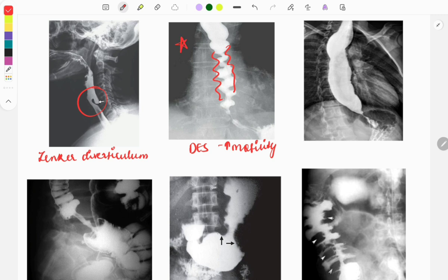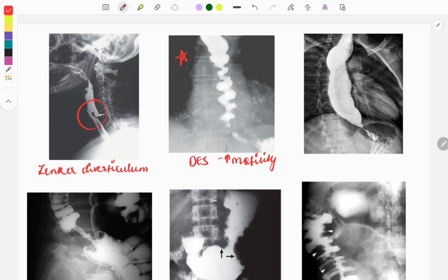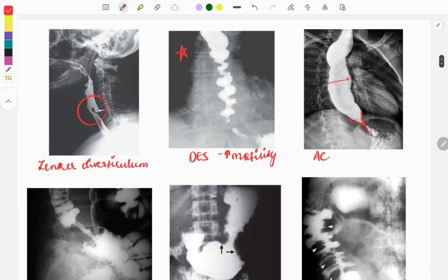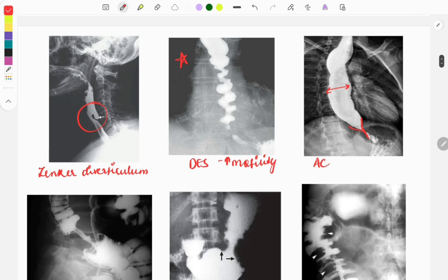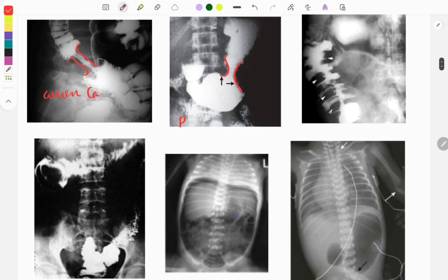This image has been asked multiple times. The next image shows achalasia cardia with a bird beak appearance and a dilated esophagus — it is a hypomotility disorder of the esophagus. The next image shows apple core deformity, seen in colon cancer. Another image shows stenosis of the pylorus with incomplete passage of barium, suggestive of pyloric stenosis.